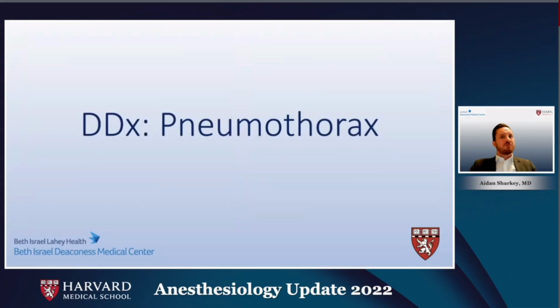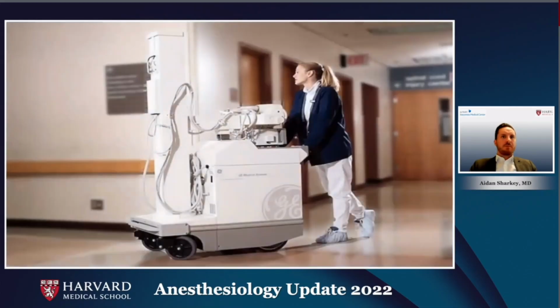On top of our differential diagnosis is, does this patient have a pneumothorax after her block? Remember that the pleura is very close to where we inject for a supraclavicular block, and a pneumothorax is a well-known complication with this block. Our patient is not clinically unstable at this stage, however, so further investigation is prudent. And usually this takes the form of a portable chest X-ray.